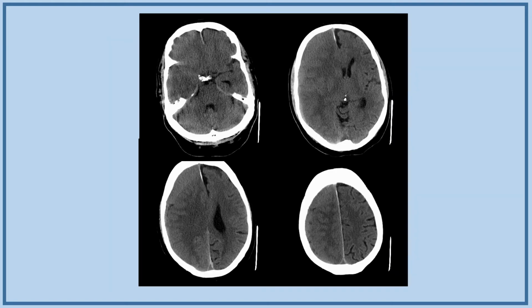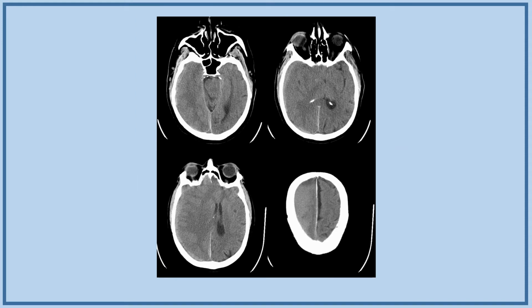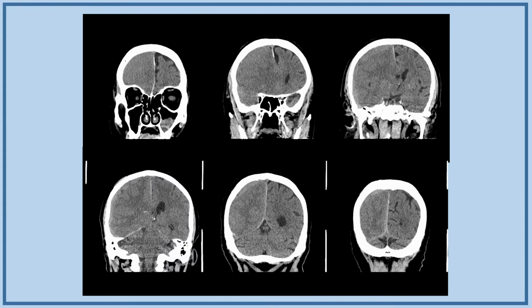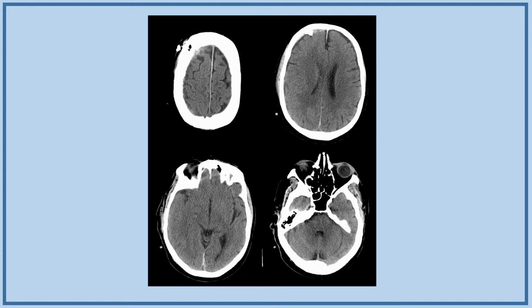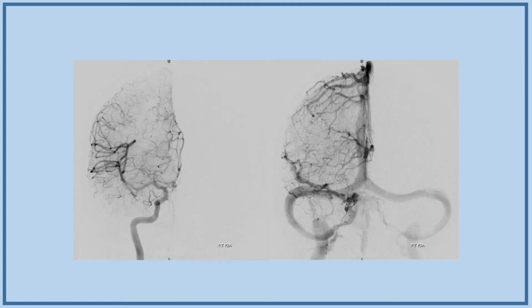So here's a very nice example of an isodense subdural. You can see a better one, but it's a pretty good one. Here's one more, a few days later, after he got transferred to us. And that's the coronal. We did a CTA. Anyway, this is after some drainage, and now we're going to follow it up with an MMA embolization. There's the frontal, still some mass effect there.